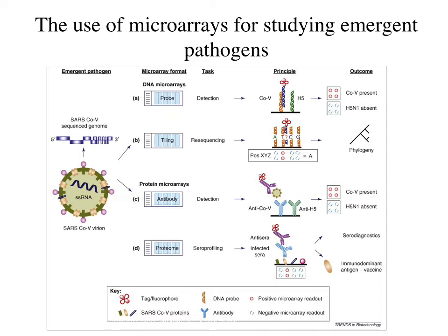And then in C, you can see antibody arrays make use of the sandwich immunoassay to screen for the presence of a pathogen. As depicted, the pathogen sample is first applied to the microarray, followed by the reporter antibody. As a result, the pathogen is sandwiched in between 2 antibodies, an immobilized antibody, blue, and a tagged antibody, purple, capable of reporting the presence of a pathogen on a microarray.